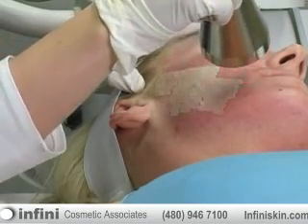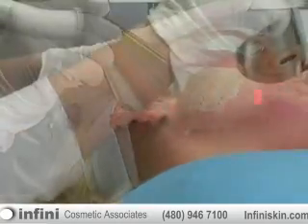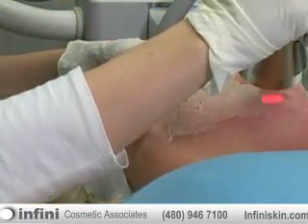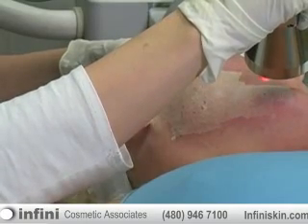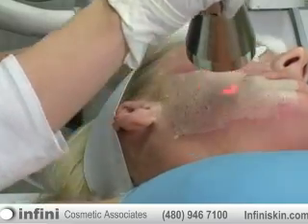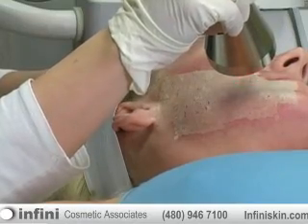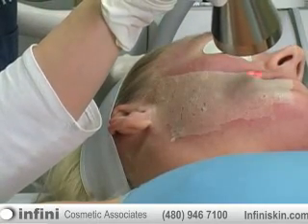It's a very superficial peel that takes off the superficial dead layers of skin and just a little bit deeper to help combat fine lines, fine wrinkles, and pigmentation. The recovery is actually very, very quick. Most of our patients, after having these micro laser peels, typically recover over a 24-hour period and then they're able to put a mineral-based makeup on or a light foundation and get back to work usually within 48 hours.